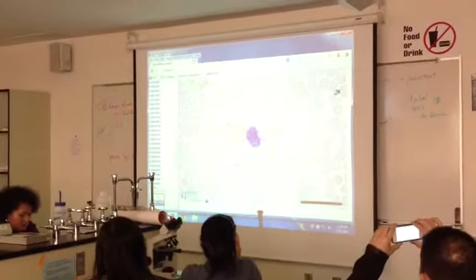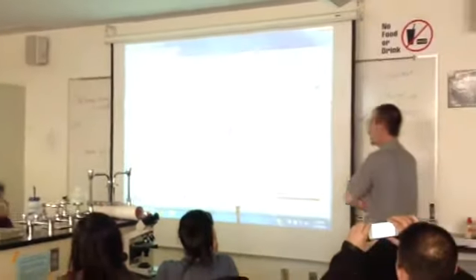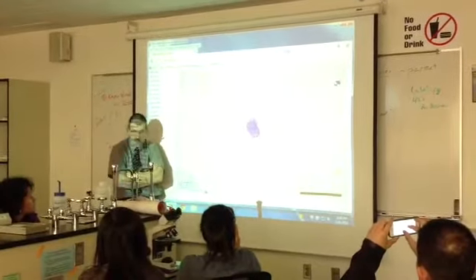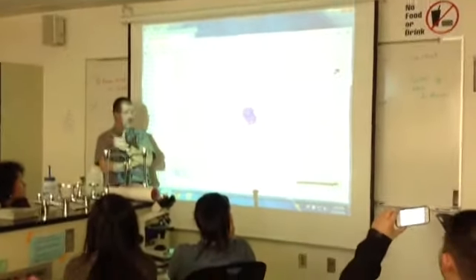That looks like a monocyte. That's a monocyte. This is actually one of the harder ones to name because they vary a lot in their size and shape. Your book will say they're always bigger than the reds. That's normally true, but not always. So don't use size as the sole criterion.